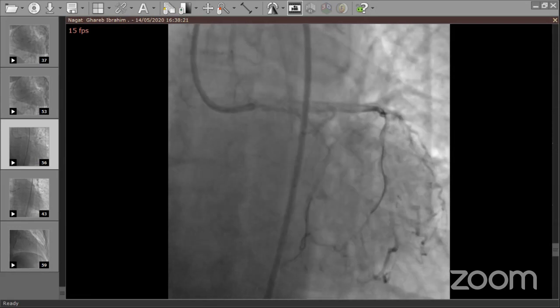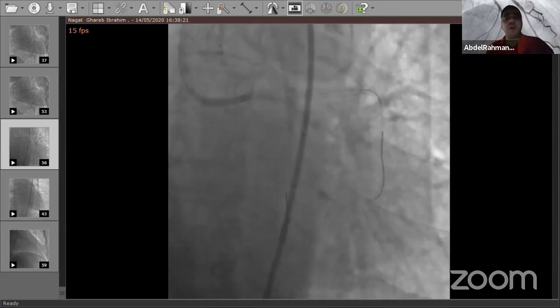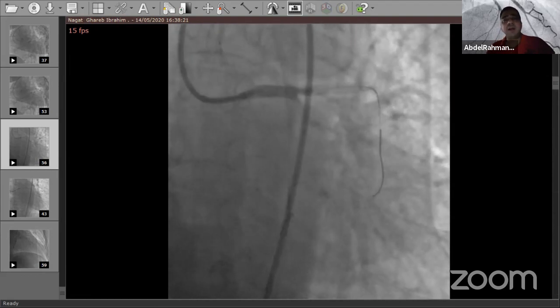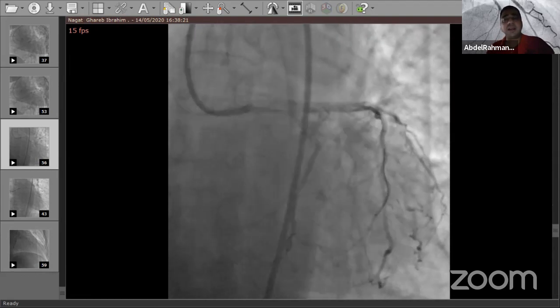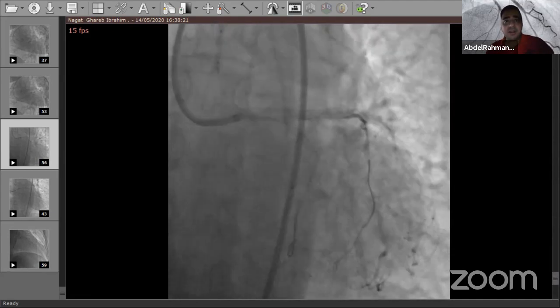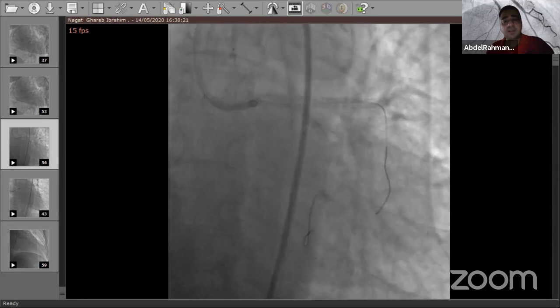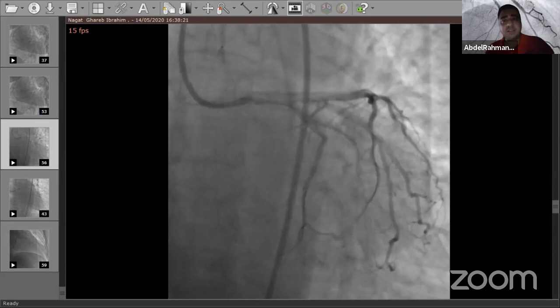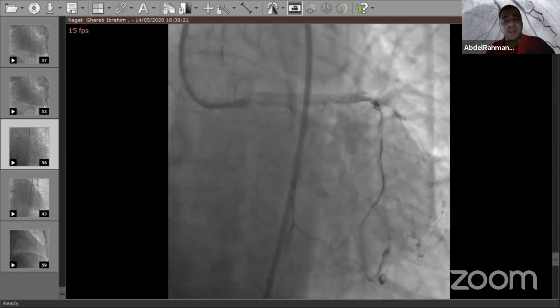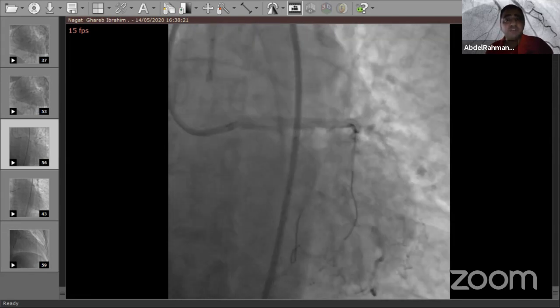Karim? Okay, before Karim, I would like to thank you, Haysam. In all my left main complex procedures, I do an angiogram after 1 year. This may not be following guidelines or recommendations, but in all my left main patients, I do a routine coronary angiogram after 1 year.